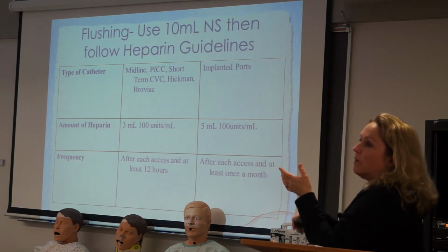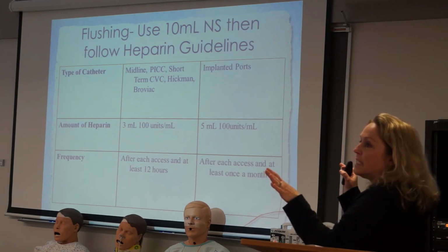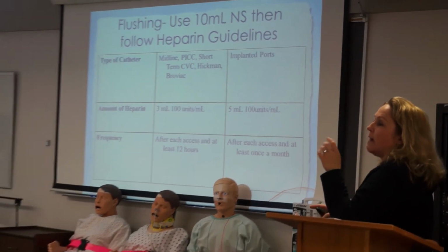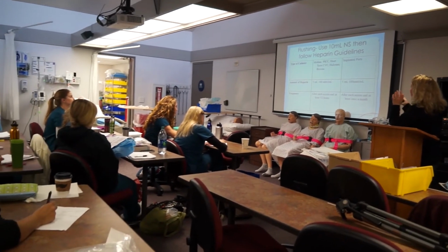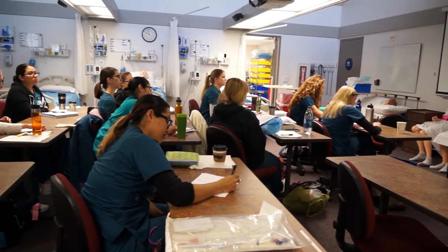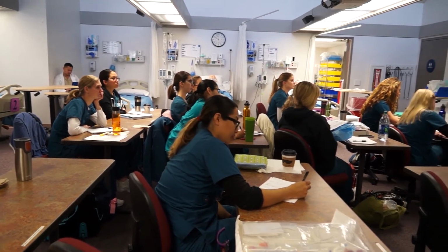They'll go in, get their chemo. After the chemo treatment's done, they flush it, they heparin lock it. They're good for a month, and that heparin just stays in there. But if their next treatment is not for a month and a half or 2 months, they may have to go back and have it heparinized again and flushed again. So if you take good care of your central lines, keep them heparinized and flushed appropriately, they'll stay open for you and continue to work for a very long time.